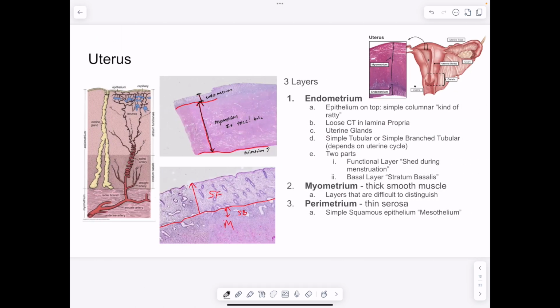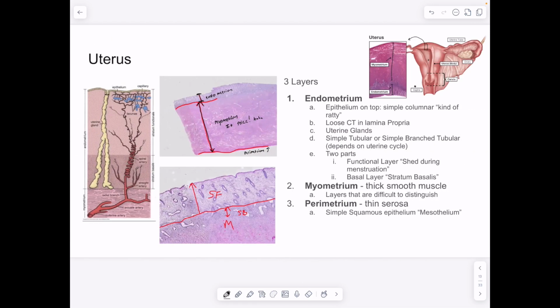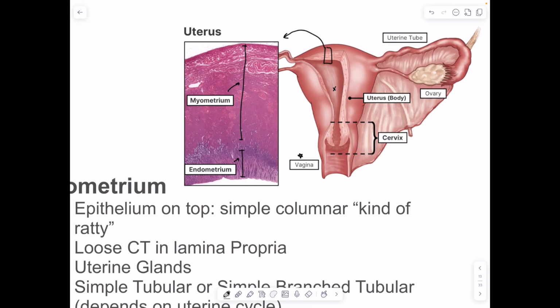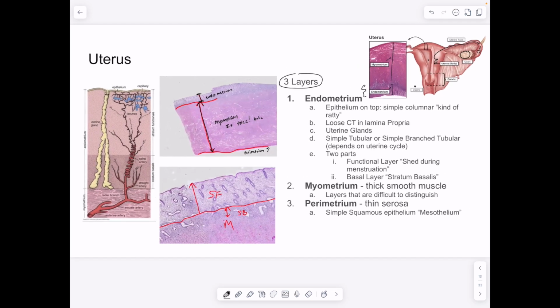So moving on, and hopefully our zygote is moving on as well into the uterus. The uterus has been undergoing some changes, which we'll talk about, but the basic idea is that there are 3 layers to the uterus. Again, we started in the ovary. We had our secondary oocyte come here. Hopefully it met a little sperm. If it did, it's going to move down here into the uterus where it will implant on the endometrium, which is right here in this particular view.